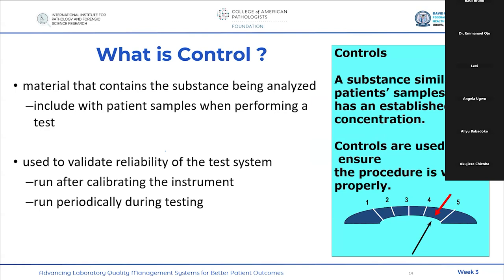And the way my manager in those days used to put it is, what we want to be sure of before we start introducing patient samples into the analytical system is that my equipment is fine, ready to deliver, the operator is fine, the environment is fine. And when my QC produces an accurate result based on predetermined results, then I can say if I put my patient sample in the same analytical system, I will get a reliable result.